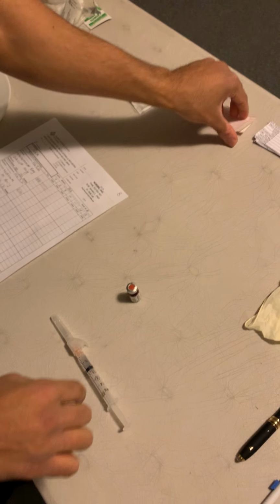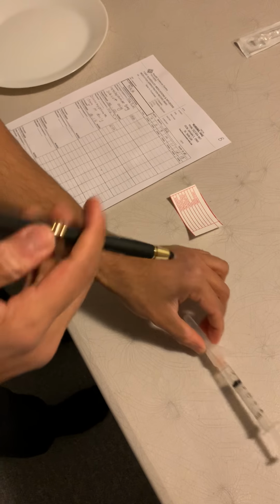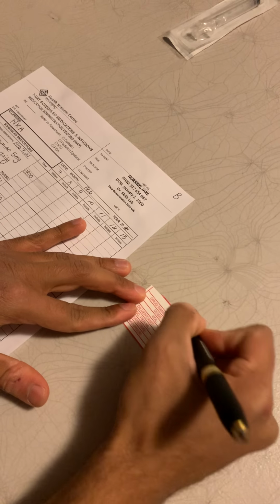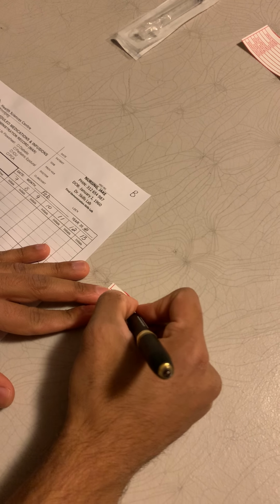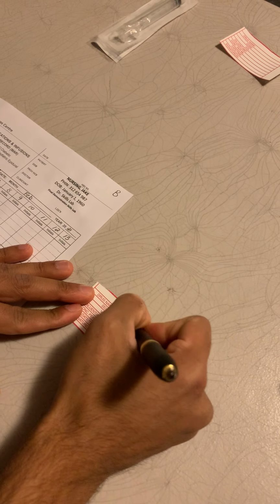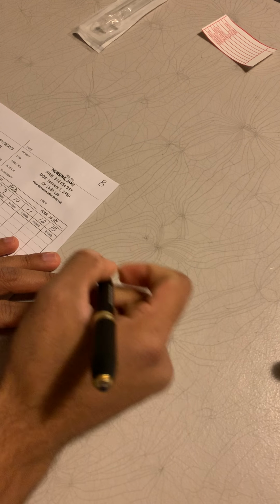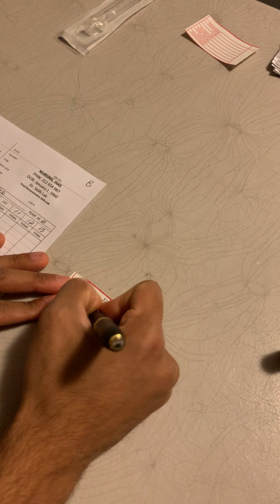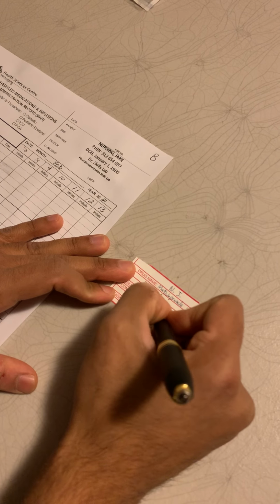Okay, now I'm going to be making my drug label for that. For nursing Jake, drug name is metoclopramide, subcut. Subcut dose is 5 milligrams of 1 ml. Concentration is 5 milligrams per ml.